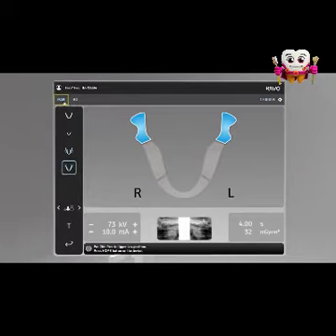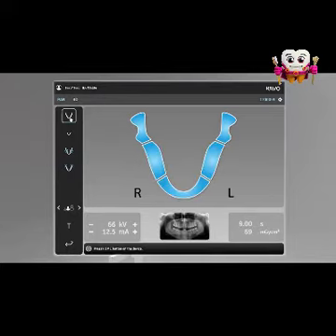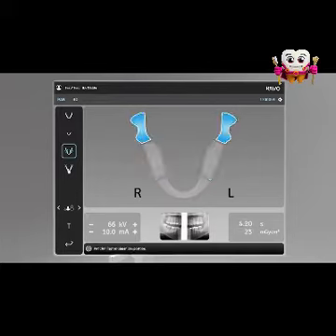Select the Panoramic tab. With the Panoramic Imaging Program selected, you can select the imaging modality. Press the imaging program icons to change the active imaging program. There are 4 imaging modalities that can be selected from the screen: Standard Panoramic, Pediatric Panoramic, Bite Wing, TMJ.